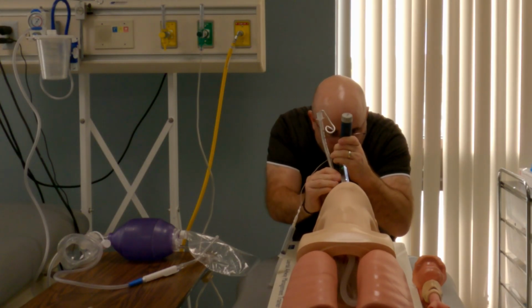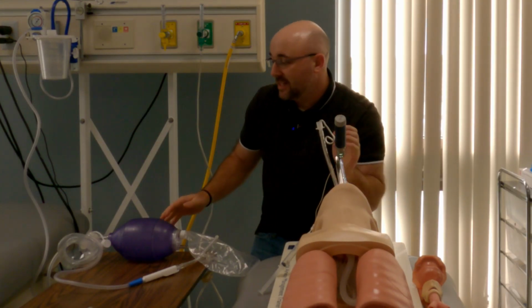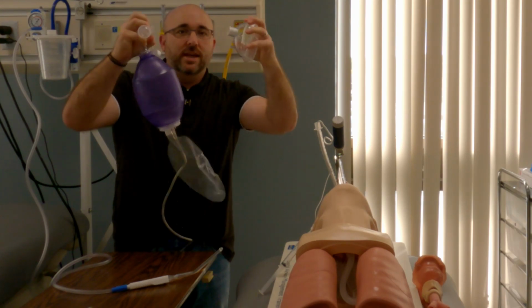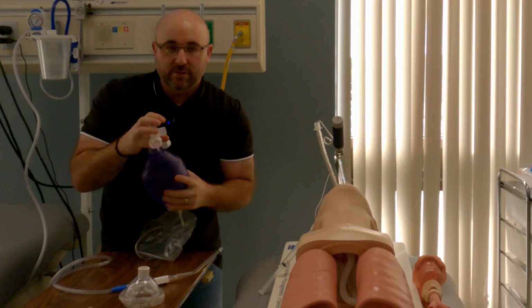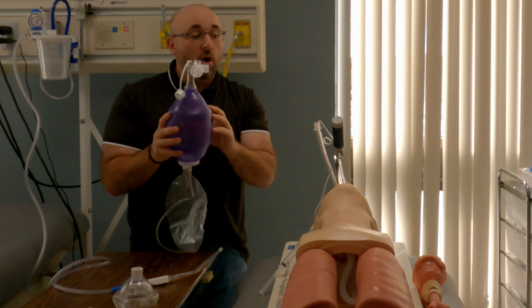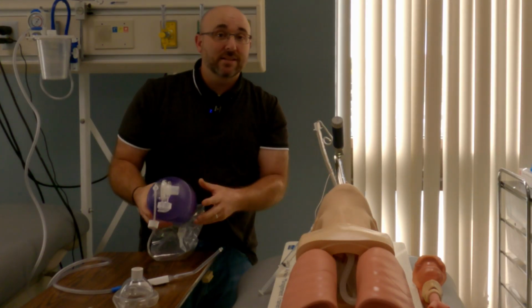While I'm trying to insert this into the trachea, the person over here that's assisting is going to be taking the bag valve mask, and they're going to remove this. So you're going to remove this off of here and set this down. Don't throw it across the room or drop it under the table or under the bed. You're going to remove this because you are expecting this tube to be in, and you're going to need to give ventilation through it so somebody can listen to breath sounds.